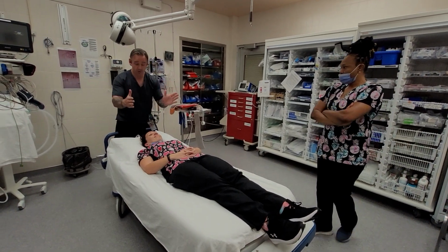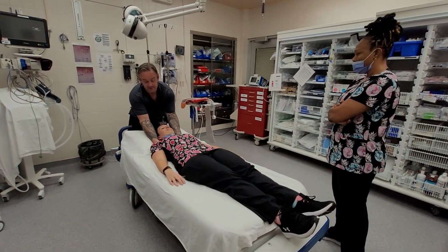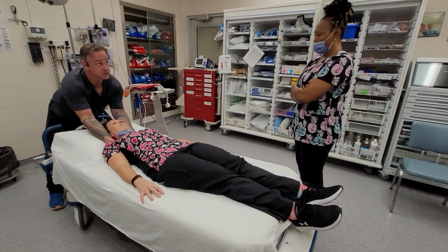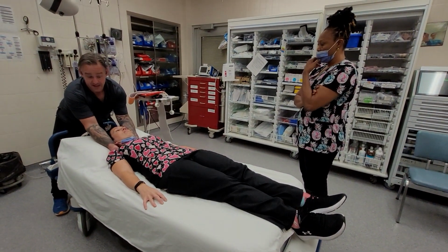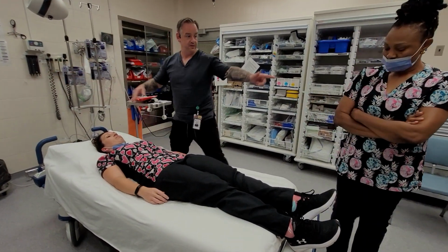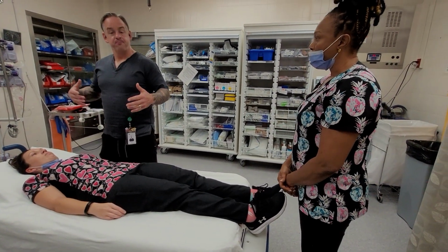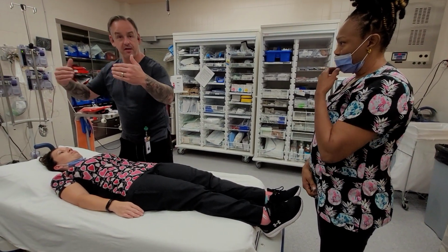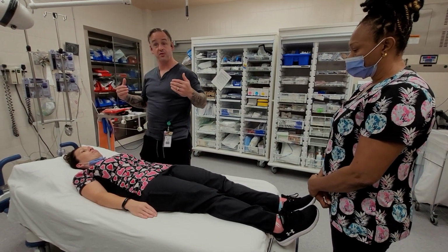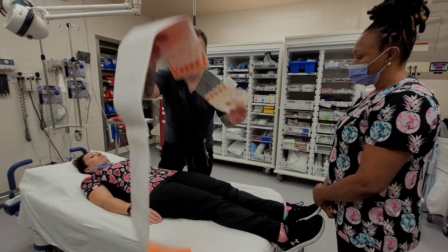So, one person's going to stabilize the head when we roll. The best way to do it is to have your hands on the shoulders and secure the head with your forearms when you're rolling the patient, and that really helps stabilize the head. For the people on the body portion, Margaret's going to join me here. We're going to decide to roll onto one side. Normally one of the clinicians is going to be on the opposite side because they're going to want to do a spinal assessment while we're doing this maneuver. That person will also want to have access to our pelvic binder to apply it.